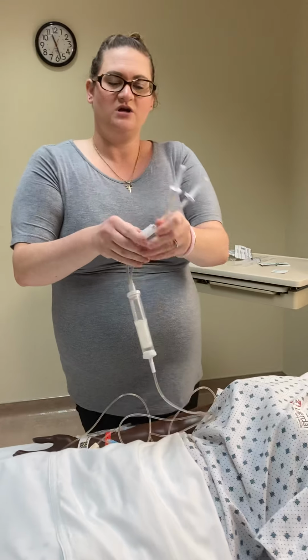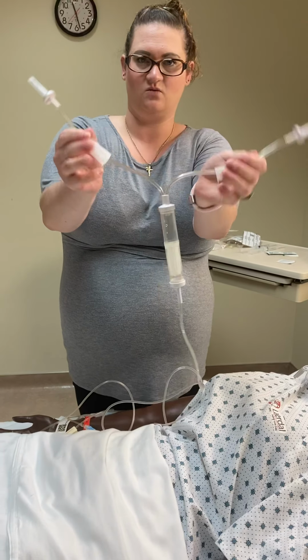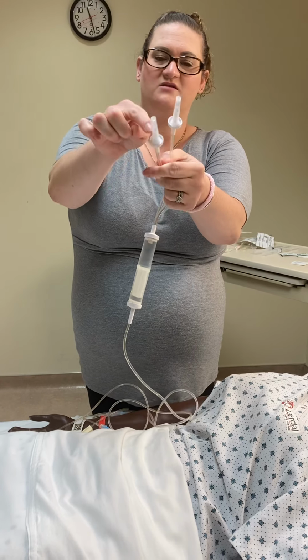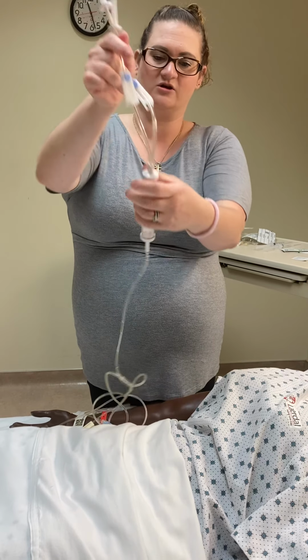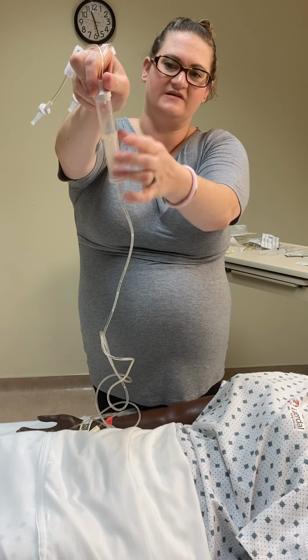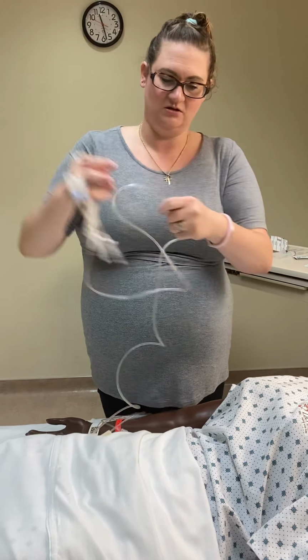So there's two, this is why it's called a Y. We've got two tails here, okay? We've got two spikes, we've got two roller clamps, we've got our vented chamber here. This is gonna help with filtering.